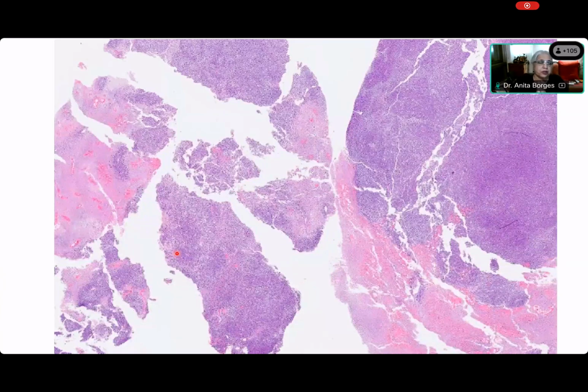And this is it. Okay, now that you did the last case, maybe you can do the last two cases. Elsa, tell me, what is different between what the last two cases were and this? This is also extremely cellular. Ma'am, these are not arising in fascicles. Okay, you can't see that. What is it that is different under low power? And that should have hit you straight away. Come on, Priya, are you there? Necrosis. Ah, yeah, she said it. It's necrosis. This is a necrotic tumor. And it is very cellular, but it is necrotic.